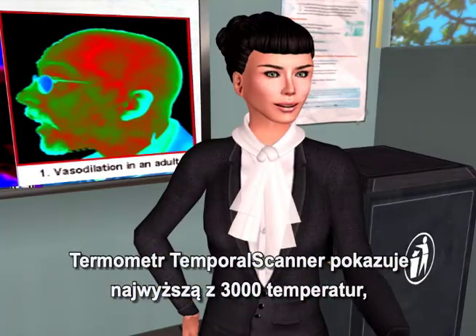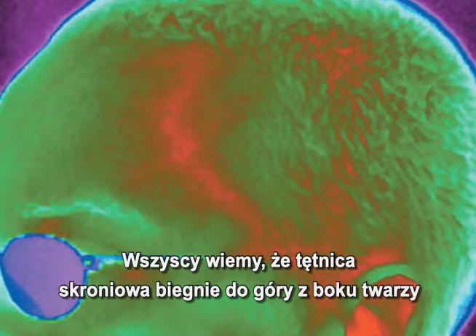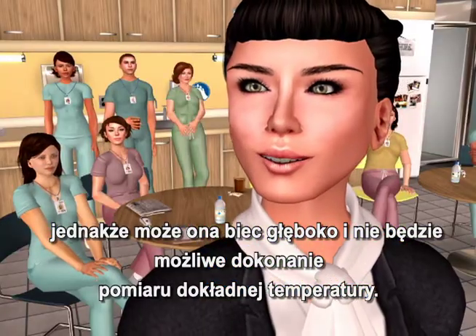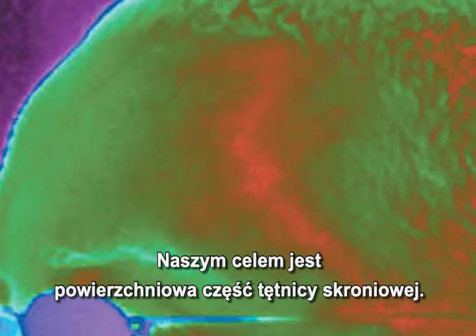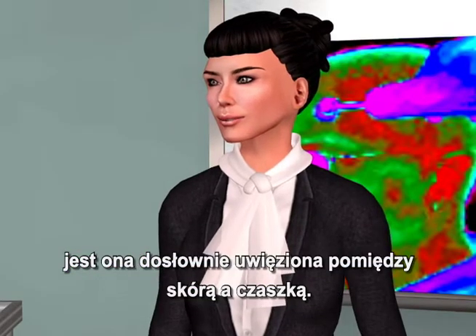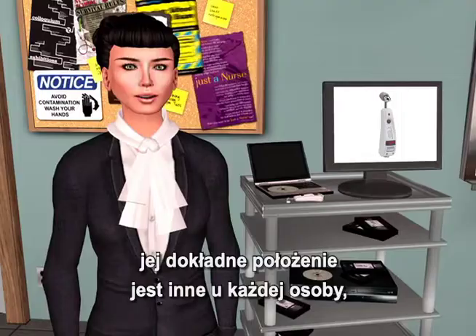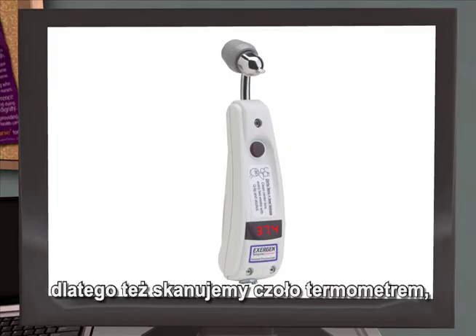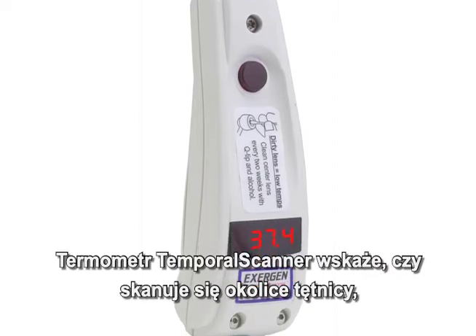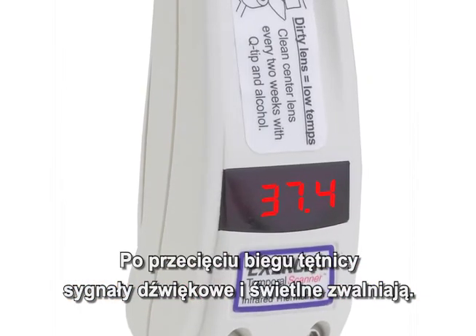The temporal scanner pinpoints the highest of 3,000 temperatures to provide the most accurate temperature possible. The superficial part of the artery is our target, located up in the forehead, about two millimeters below the skin, literally trapped between the skin and the skull — it can't go anywhere. Since its exact location varies with each individual, we scan, allowing the temporal artery thermometer to locate it, something like a radar detector. The temporal scanner indicates you're scanning over the artery by faster beeping and a faster flushing display; after you pass the artery, the beeping and display slow down.